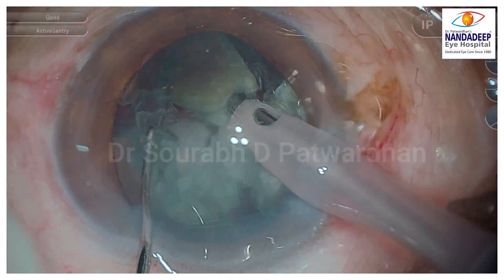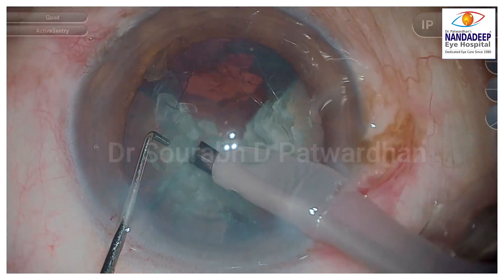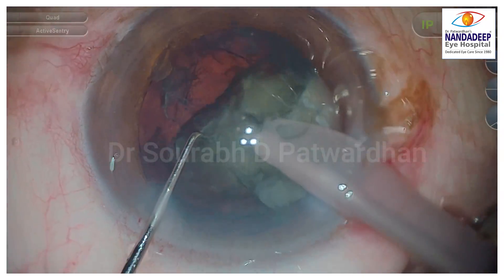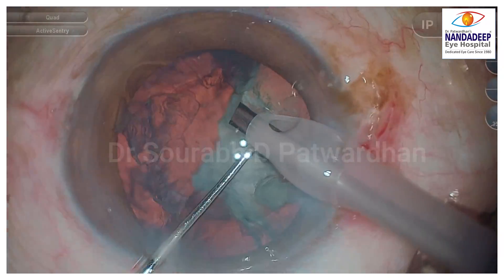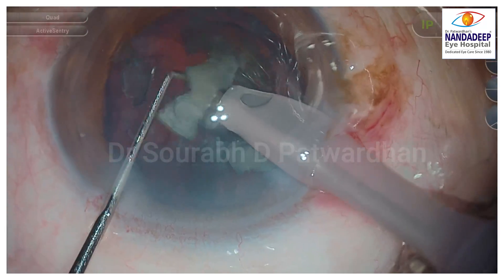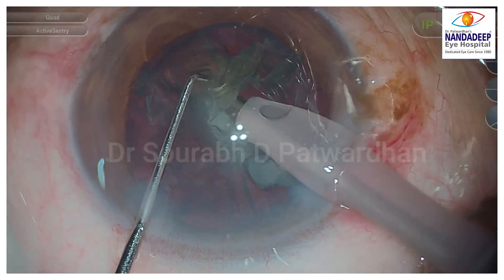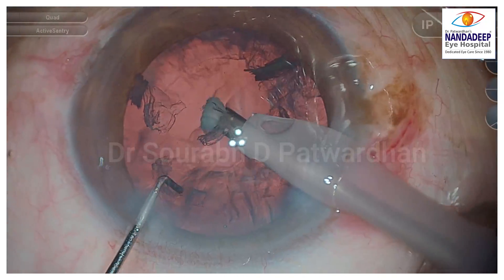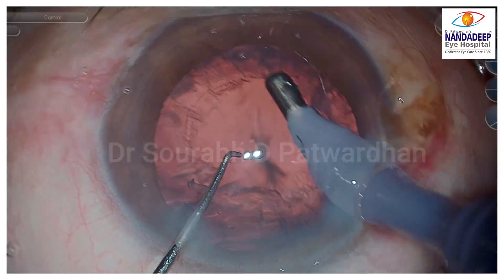I generally use pulse torsional FACO for quadrant removal — that saves some amount of FACO energy. Now watch my FACO tip at all times: it tries to stay at the center, just near that Purkinje image. Never cross or go beyond the Purkinje image midline. Try to use your non-dominant hand to push the pieces to the center. Keep your FACO tip very steady while doing quadrant removal — that's the key for safe surgery.